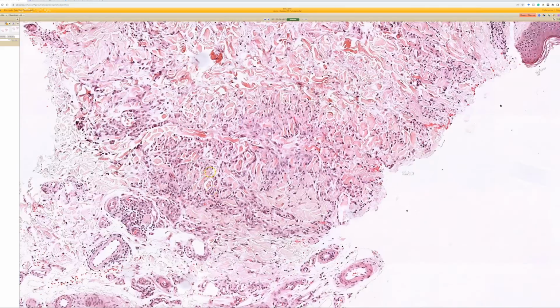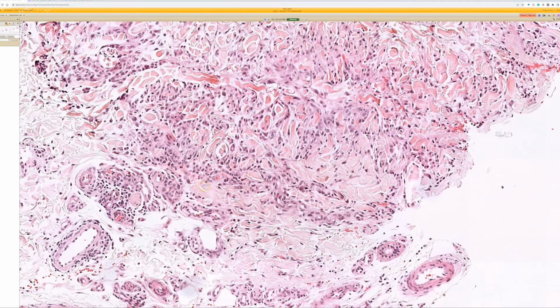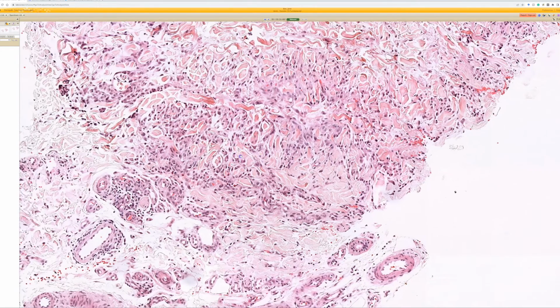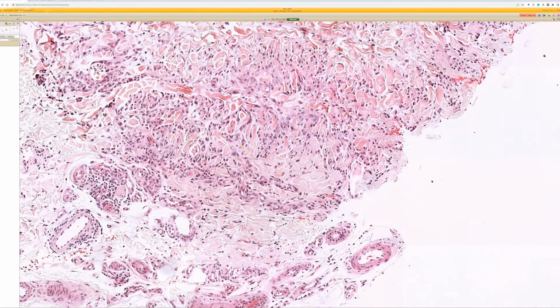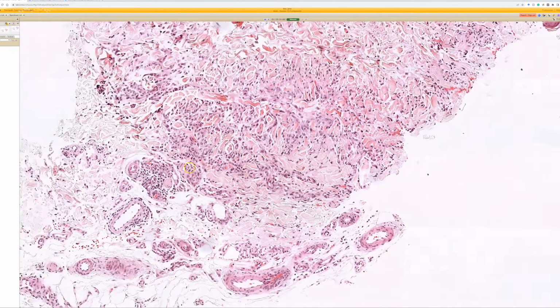Okay, the last thing I was going to mention is that in your differential between dermatofibroma and GA, hypopigmented blue nevus also traps collagen at the periphery. It can look a lot like a DF, maybe a little bit like a GA, but usually the cells are thinner in blue nevus, and there's almost always going to be a little bit of melanin. Even in the very hypopigmented blue nevus, there'll be some melanin. So that's a differential you can keep in mind. Hypopigmented DF, hypopigmented blue nevus, dermatofibroma, and the interstitial areas at the edge of granuloma annulare all have collagen trapping and can look alike.